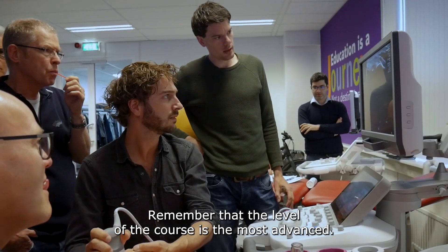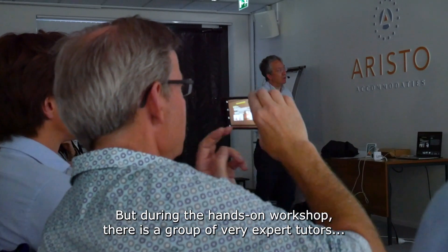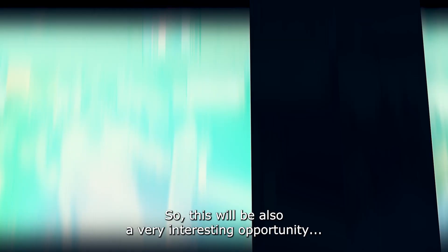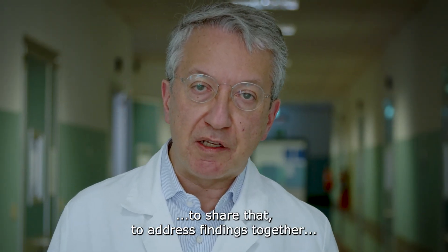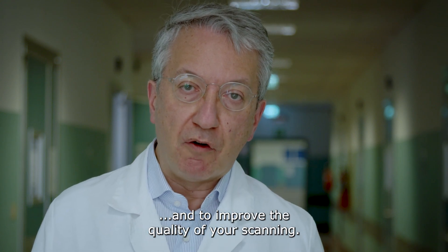Remember that the level of the course is the most advanced, but during the hands-on workshops there is a group of very expert tutors supervising people as they scan. This will also be a very interesting opportunity to share doubts, to address findings together, and to improve the quality of your scanning.